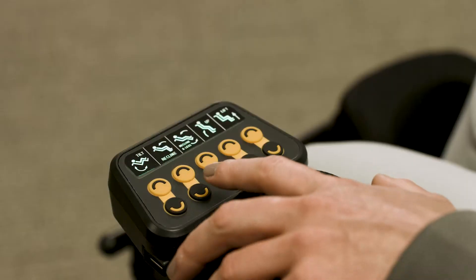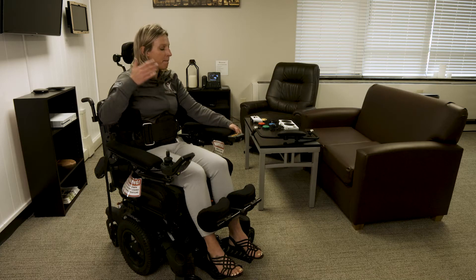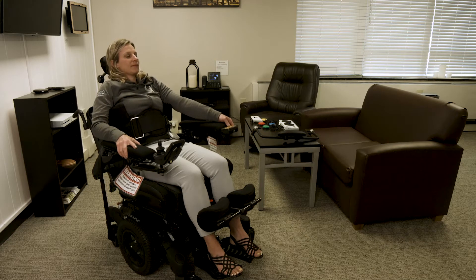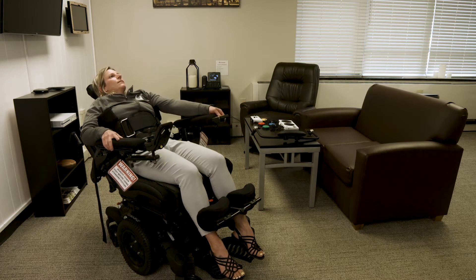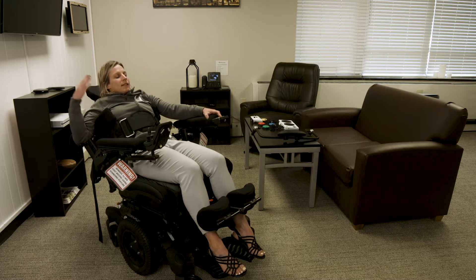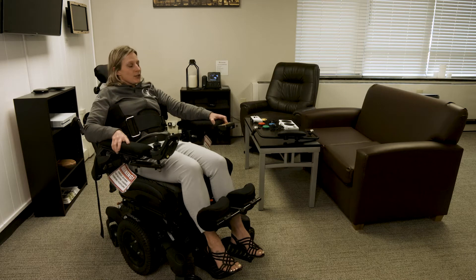First, I'm going to put on the lap belt. It needs to be pretty snug in the seated position because when you stand, it actually loosens up. And then the chest strap. There are lateral supports as well in this wheelchair. Normally, this would be fitted against your chest, but again, this is more of a basic one-size-fits-all so that everybody can try it while they're here.